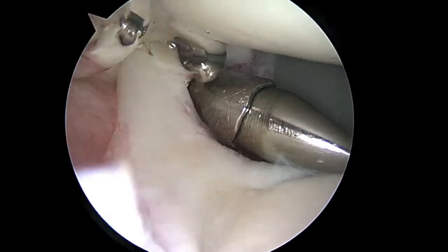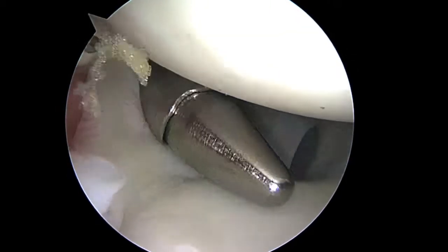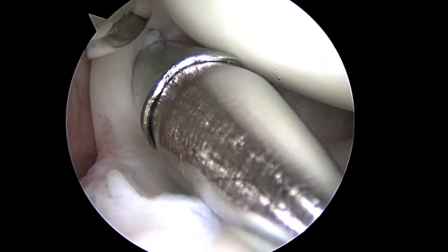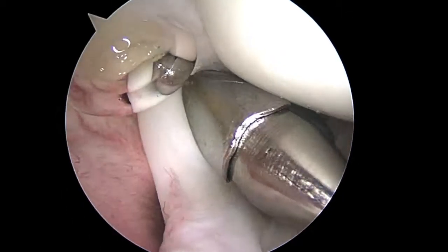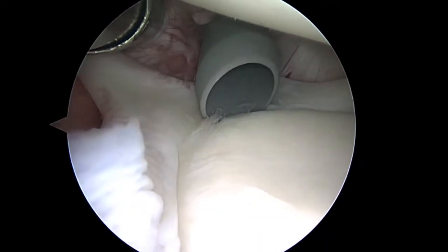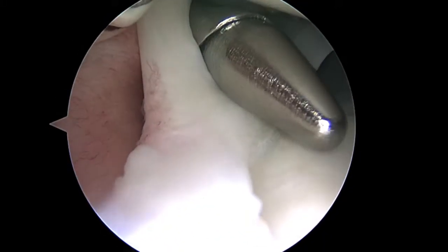Hi Desiree, it's Dr. Buefer. We're just getting started on your right shoulder. We're looking in from the back to the front. Everything that you see is magnified 30 or 40 times on the screen. We did examine your shoulder before we started, and it was loose to the back and to the front, which is what we expected. And now we're going to go ahead and take our first look at the anatomy.